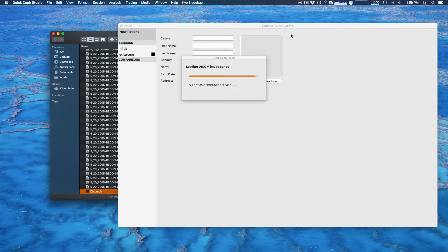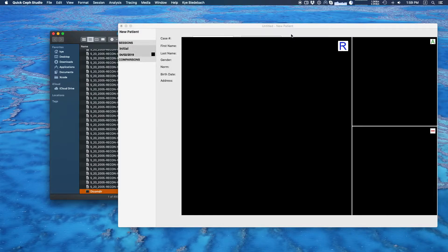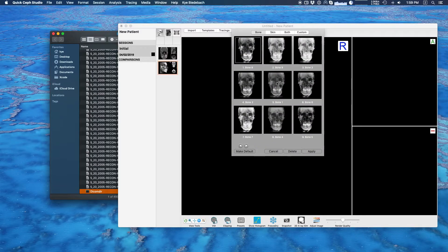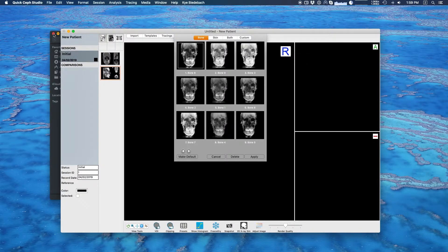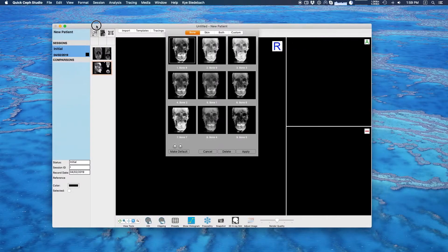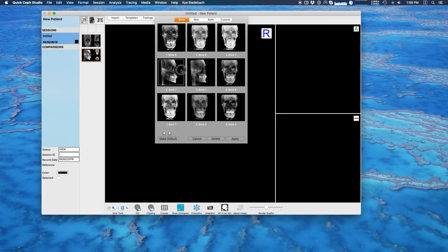When it finishes it's going to present me with a preset selector. Here are the different presets. This is a live representation of your DICOM data — this is just how your DICOM data will look when you import it.